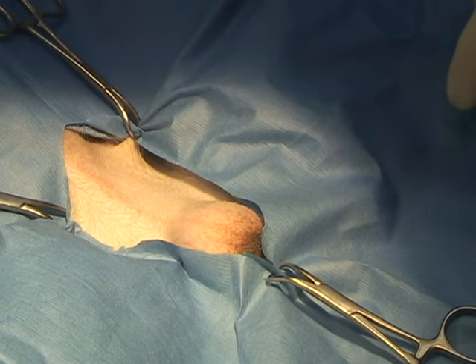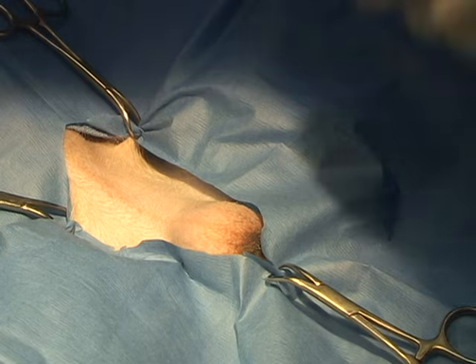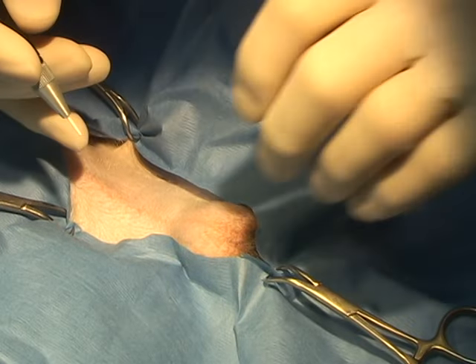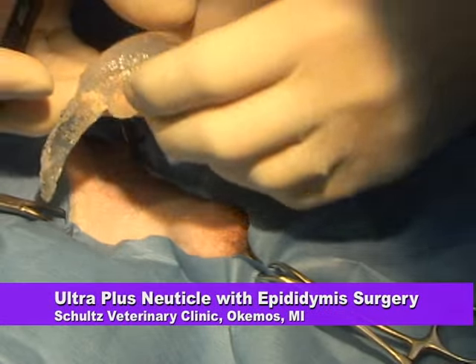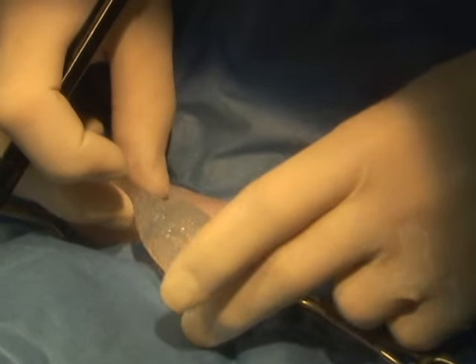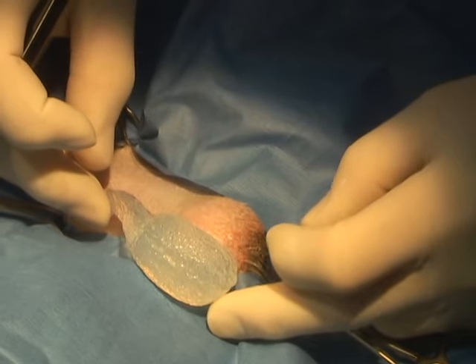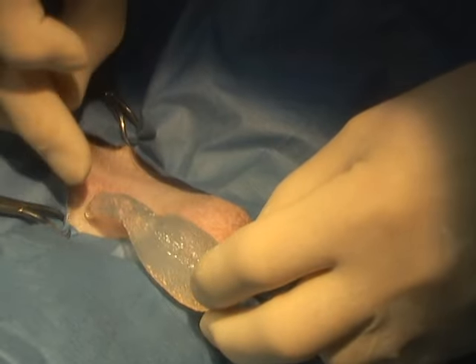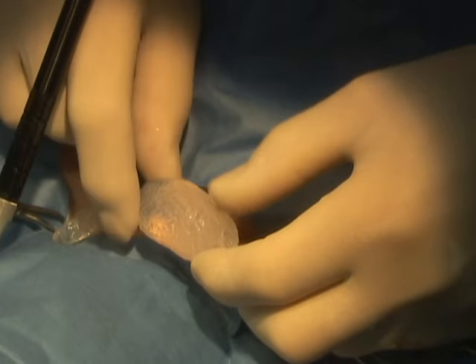In this procedure, we'll be placing an Ultra Plus Neuticle with an epididymis into a scrotum next to a testicle. The dog had a retained testicle that was previously removed, and the owners would like a second testicle in the dog. We are checking for position. We want to make sure we have the correct testicle size. The testicle has been sterilized preoperatively.